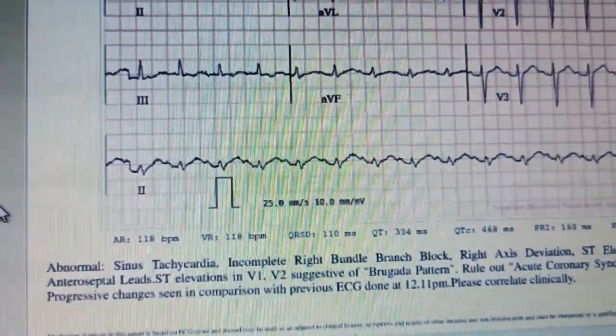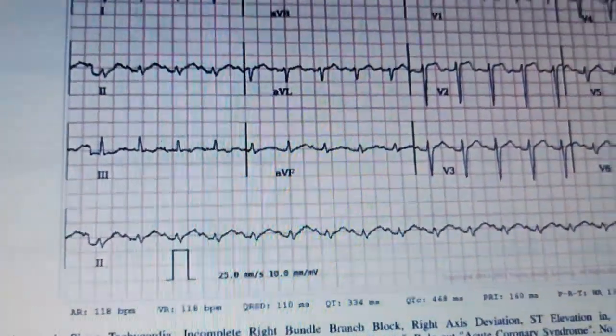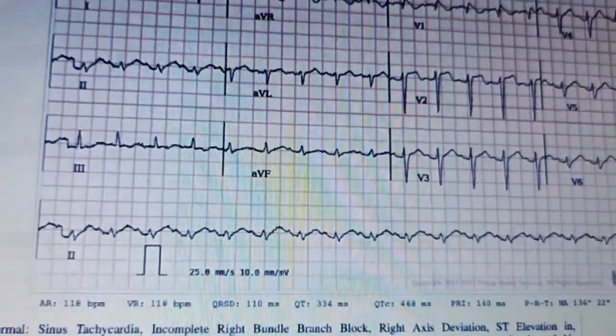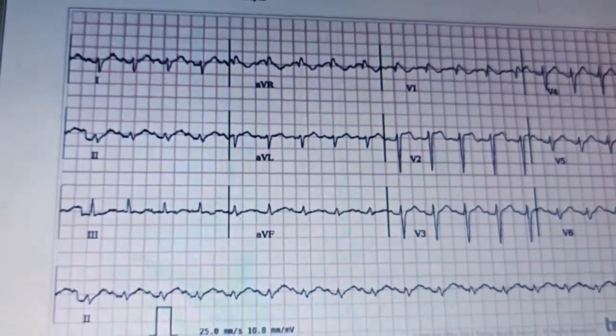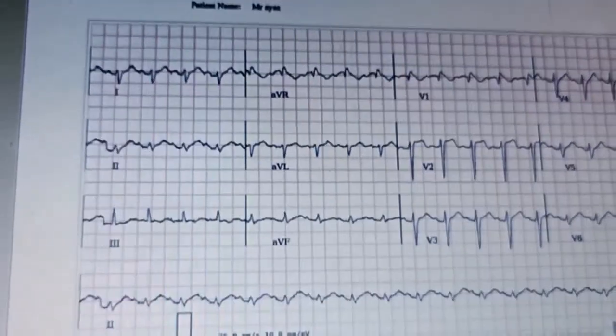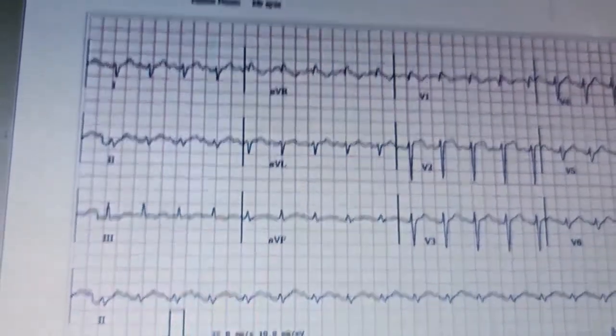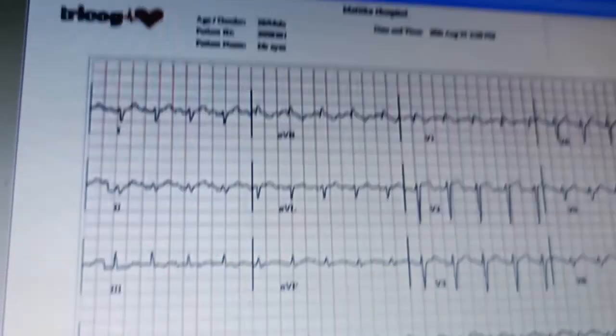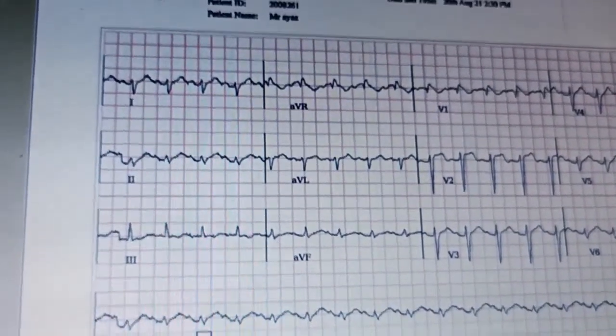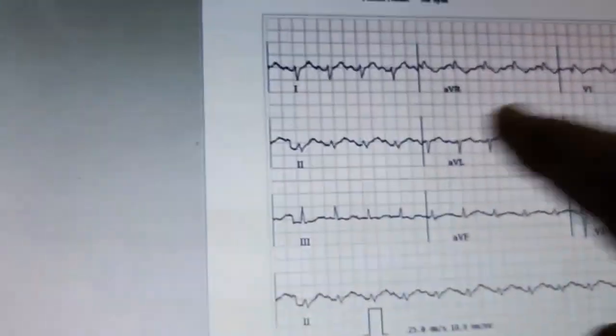Now one thing I would like to remind you of is how to estimate the heart rate by observing the graph. I think it is certainly in your conception that the heart rate is estimated using the 1500 method, where we consider two consecutive R waves and the difference between their occurrences.